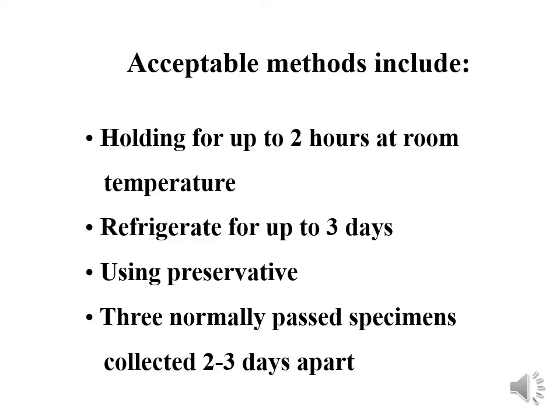Anyhow, it's not possible to examine all stool specimens within half an hour or an hour. So there are some acceptable methods that include, for example, to keep or hold the stool specimen for up to 2 hours at room temperature. It is also advisable to refrigerate for up to 3 days, or to use a preservative that can keep the parasite within the fecal specimen.